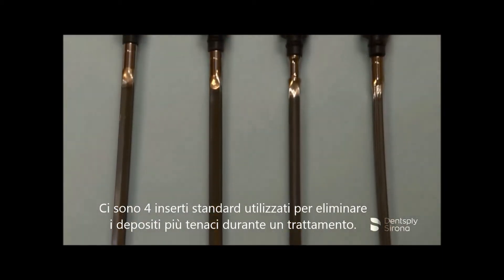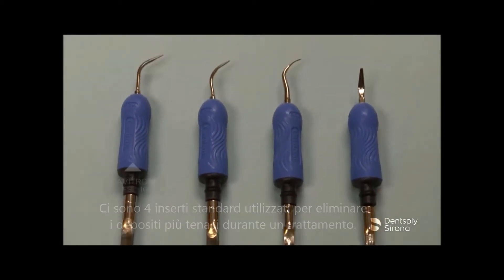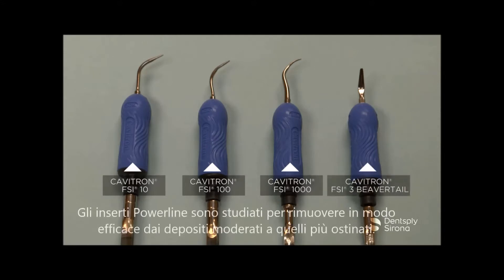There are four standard inserts commonly used during initial gross debridement procedures: the Cavitron FSI 10, the Cavitron FSI 100, the Cavitron FSI 1000, and the Cavitron FSI 3 beaver tail. The standard diameter inserts are specifically designed for efficiently removing moderate to heavy deposits.